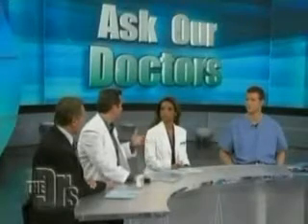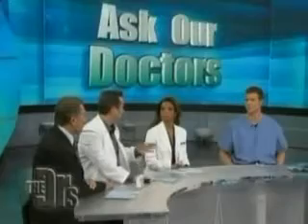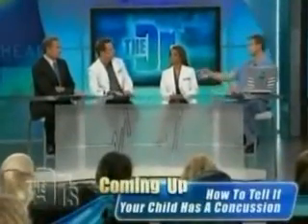You'll see somebody during an asthma attack down in the 80s, 70s, and that means it can be pretty bad. But they need extra oxygen. If your child is struggling to breathe, you need to go see a physician. Right. These can be very late in showing respiratory distress. There are other things we look at as doctors. This is a neat tool.